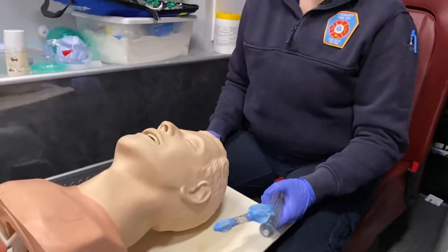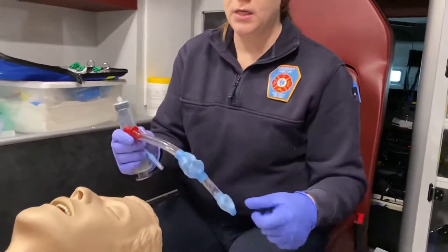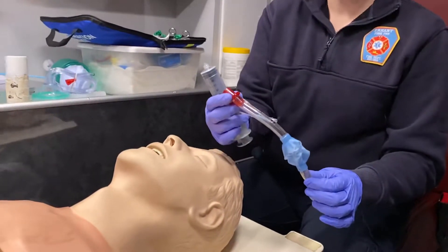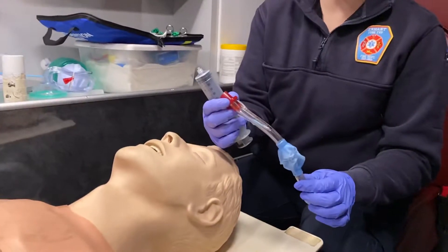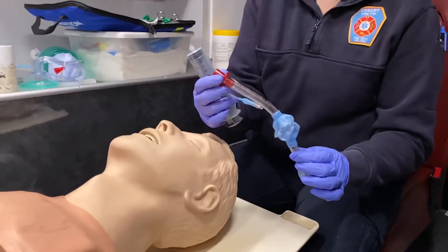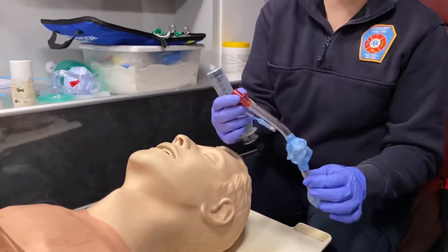Next we're going to go over the King Airway, another supraglottic airway device. These are color-coded as well, like the i-gels, and you're going to pick your color based on the patient's height. We typically use a number four, which is the red King Airway, and that is for our five to six foot person. There is a larger size for six foot and above, a smaller size for below five feet, and we also have some pediatric sizes.